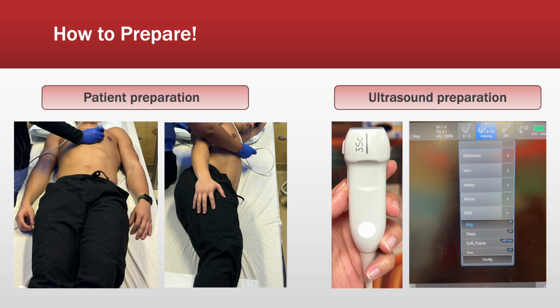So here's just a quick picture of a patient laying in the supine position. This is the optimal position that you want to obtain your cardiac views. And then again, if you're having difficulty visualizing the heart in this position, you could simply have the patient lay in the left lateral decubitus. I also sometimes have them bring their arm up underneath their head because it allows for opening of that rib cage on the left side, which gives you a little bit more space to fit your probe.